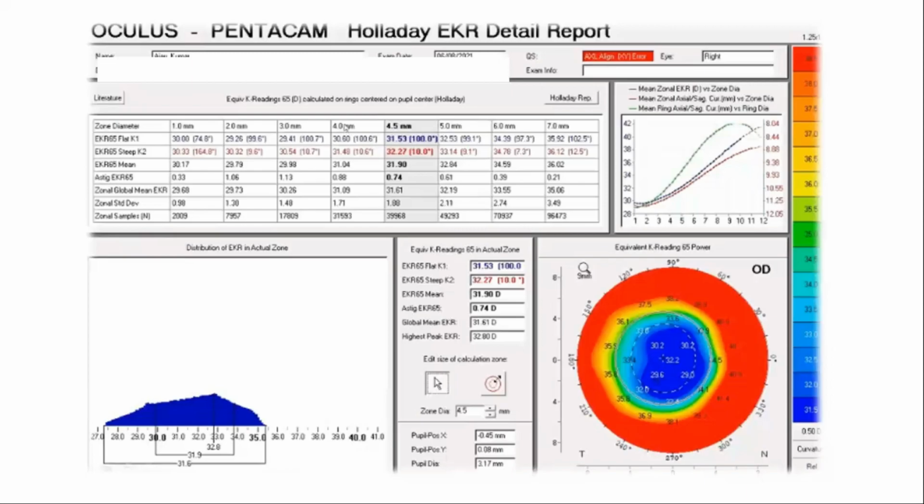Yeah, so the Eye Trace actually combines aberrometry and topography, whereas the Pentacam does topography derived from Scheimpflug images, but it also gives us posterior corneal measurements, which the Eye Trace does not give us. Whereas the Pentacam does not give us the lenticular aberrations and the whole eye aberrations as well as the Eye Trace does. So each of them has their strong points. Pentacam is very strong when it comes to corneal measurements of every kind.